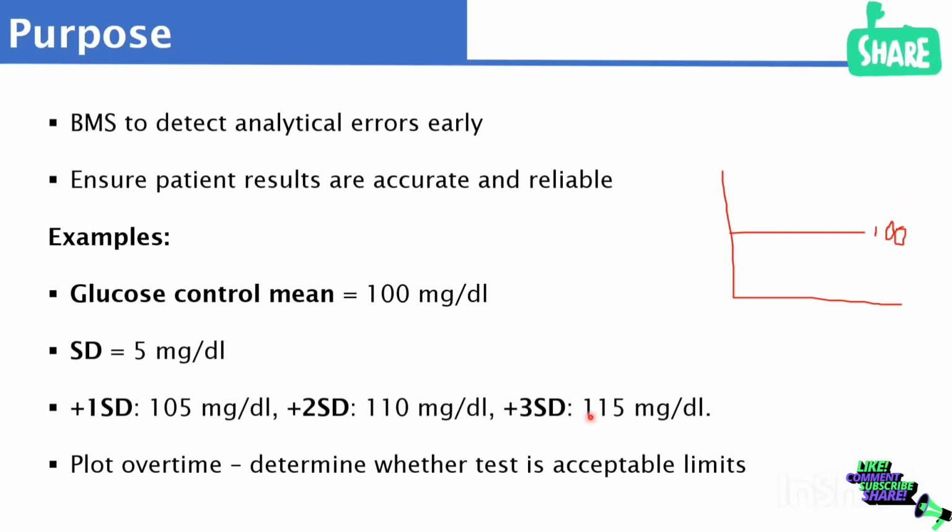So the more the SD is added, the farther the result is from the mean, which is actually what is supposed to be. Do you understand? And that is why once it is far from the mean, we start suspecting, wow, what is the problem? We know that it can be far from the mean, but the degree, the level at which it's far from the mean suggests a number of things that require investigation.